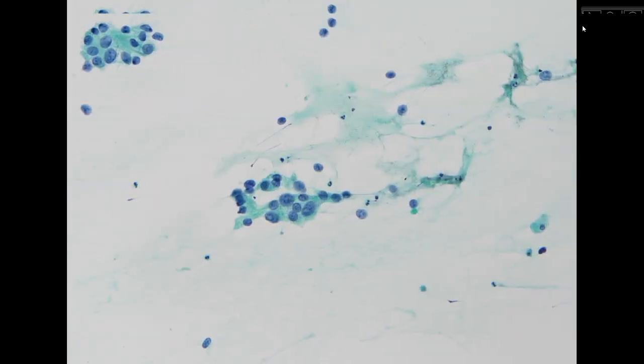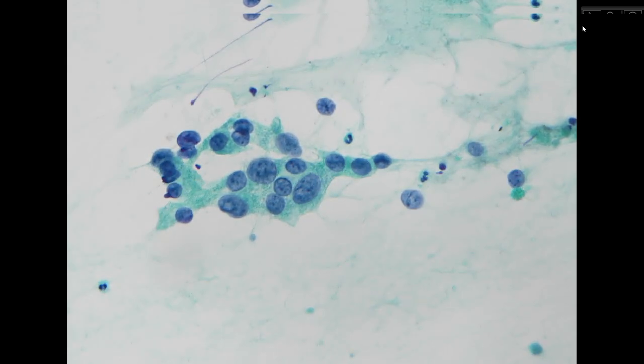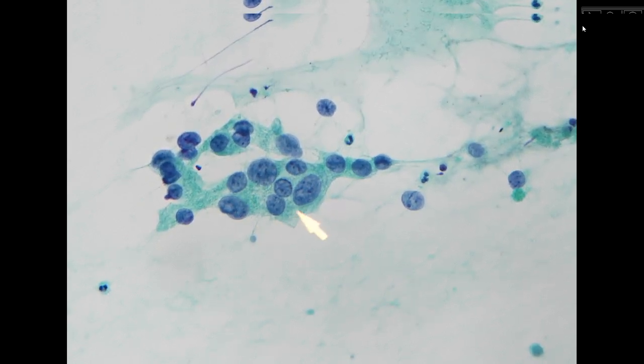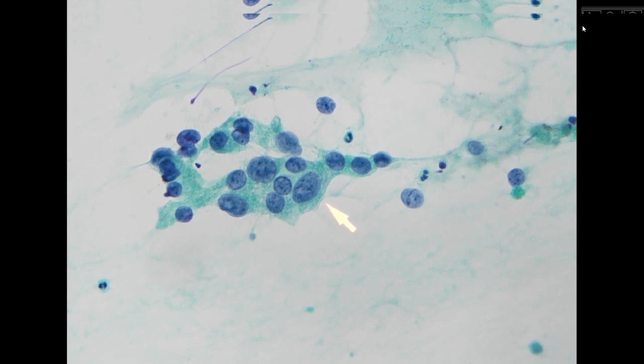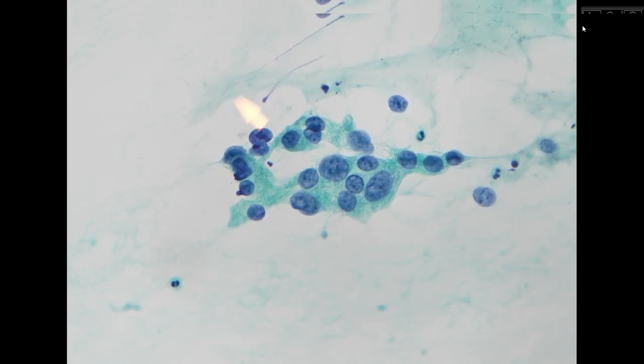As you can see, in the background, we do not see a lot of normal cellular component, but here you can appreciate that in this cluster of cells, the variation between the size of the nucleus exceeds what we call the 1 to 4 rule. This one is 4 times bigger than the adjacent smaller nuclei, within one cluster, which is a clear sign of dysplasia. So this is consistent with an adenocarcinoma.